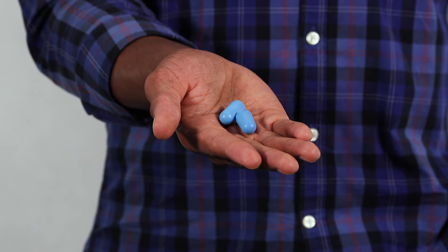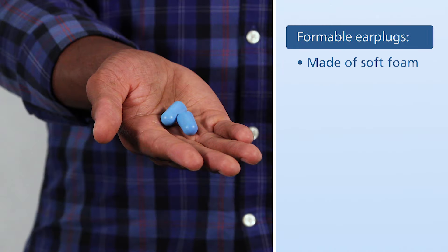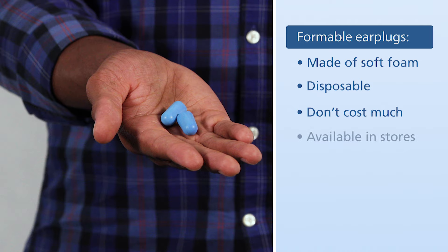These are formable earplugs. Formable earplugs are typically made of soft foam, are disposable, don't cost much, and are available in a variety of stores.